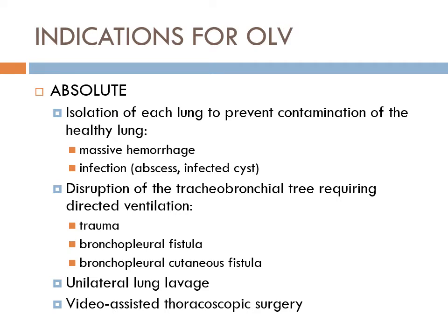So for instance, if it comes to intubating a patient, the best intubating conditions are paralyzing them, giving medicines so they don't remember things that induce them, right? The analgesia, amnesia thing. But how do you know when they're ready? What you really should do is put a train of 4, typically over the orbicularis oculi. Is probably more consistent with vocal cord paralysis. It's a lot harder to paralyze your diaphragm. Or you could put it on your ulnar nerve, right?